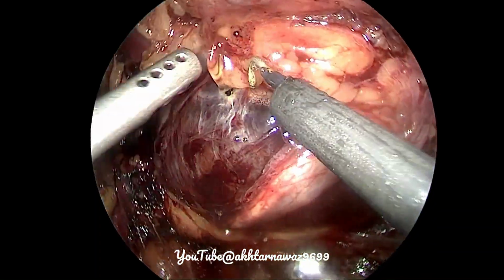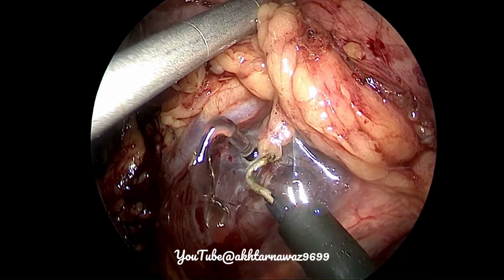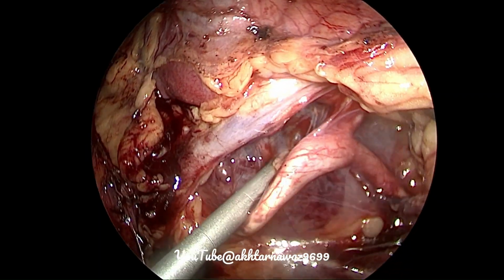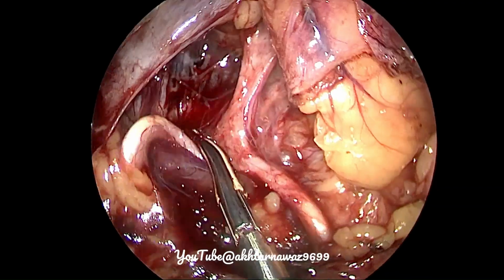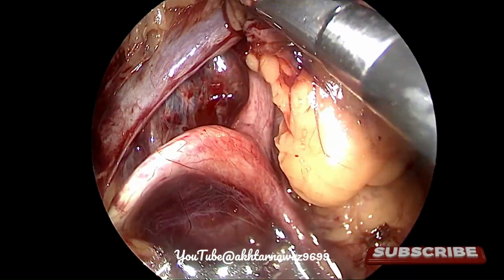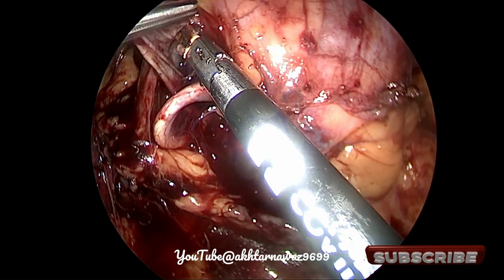So we decide that we go for the puncture of the cyst from the above, and then we suck all the fluid, so that when the cyst disappears, you can see all the three calyces with the elongated infundibuli, as well as the pelvis and the stent within the upper calyx.